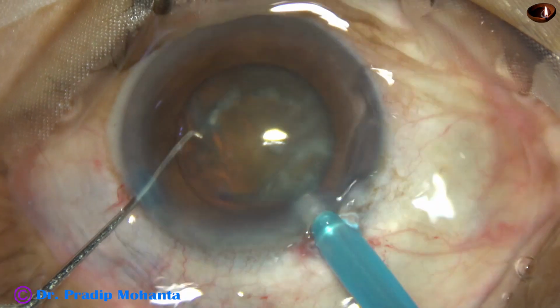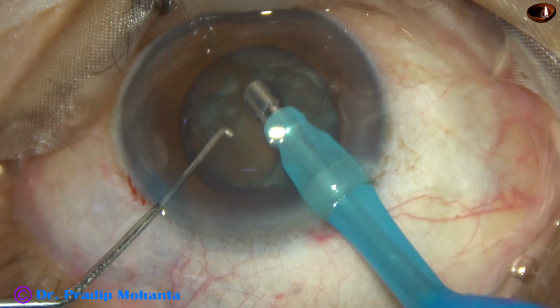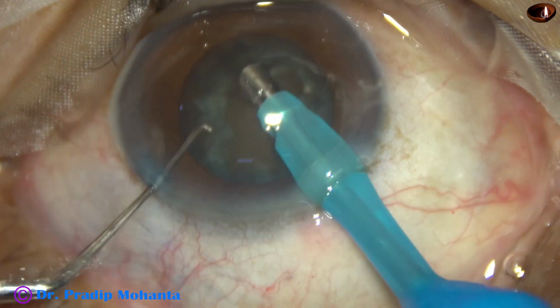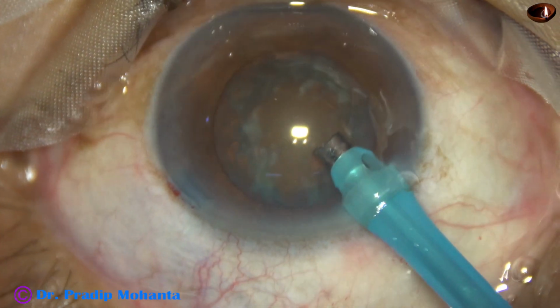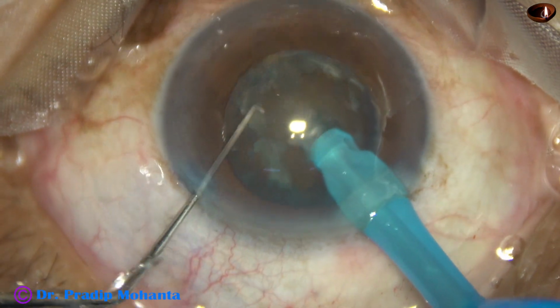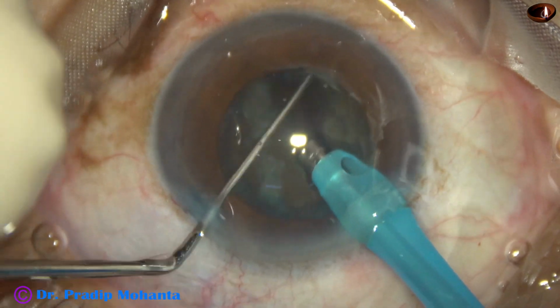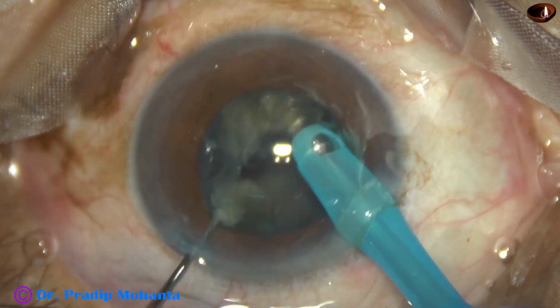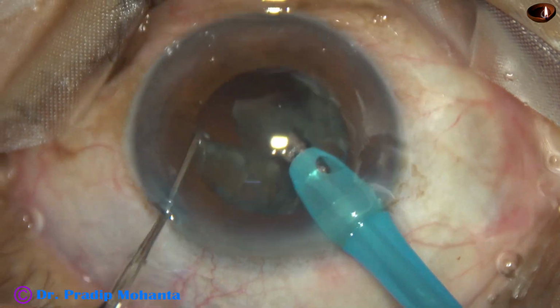After the initial steps, the phaco needle goes in, some superficial cortical lens matter is removed, and now the handpiece is turned to make the bevel up. The nucleus is chopped in this way. This is the first crack. The nucleus is rotated. This is the second chop. The nuclear fragment is free and I emulsify this piece.